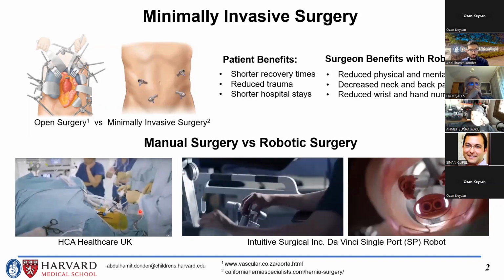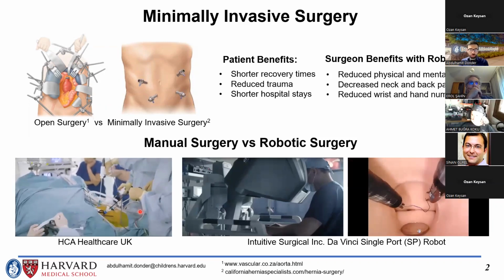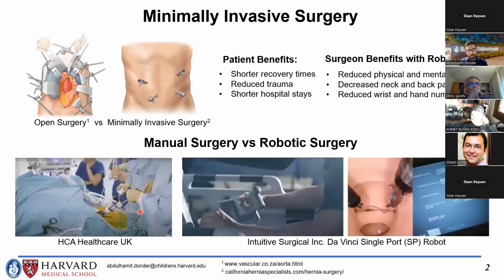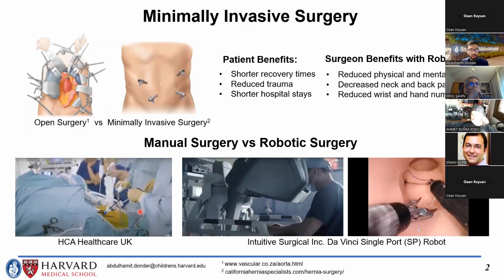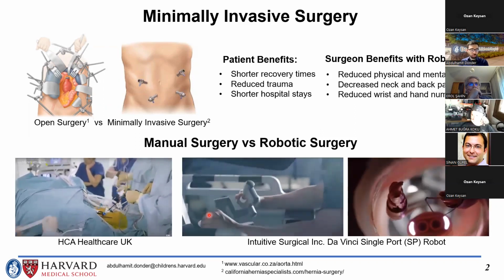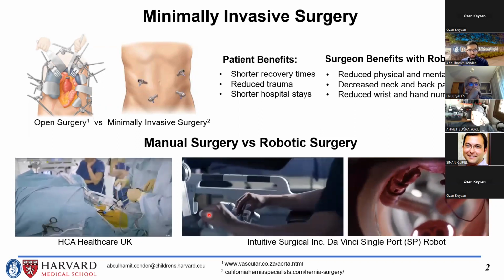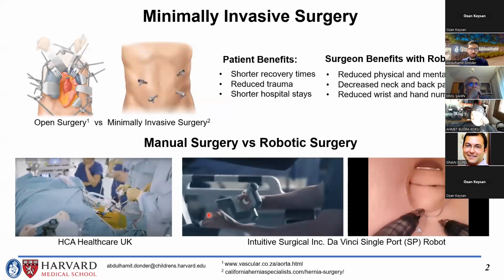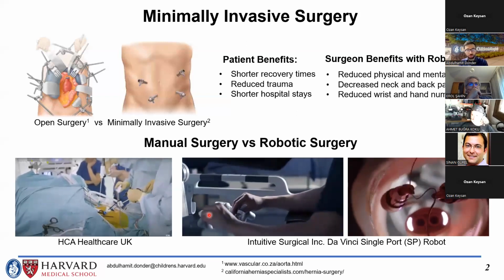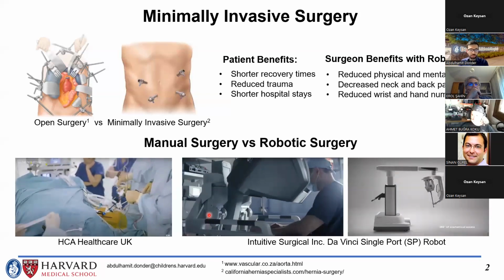For example, here in laparoscopic surgery, the surgeon has to move their hand right to move the tip of the instrument left, and up hand movement corresponds to down tip movement. These mental remappings unfortunately increase the cognitive burden of the procedure. To solve these problems, research into integrating robotics for such procedures and using better input devices has been the hottest topic studied by many research groups and surgical robotics companies for the last several decades.